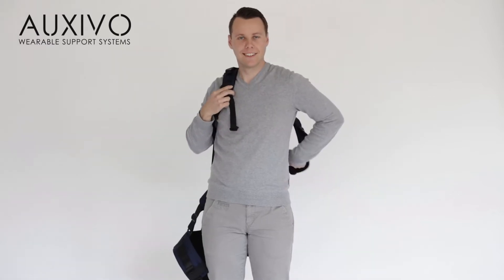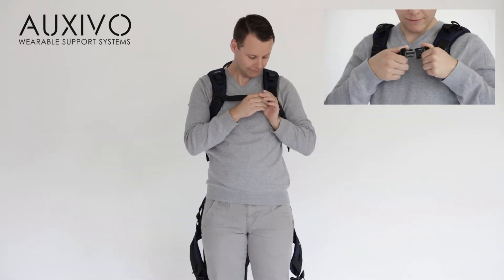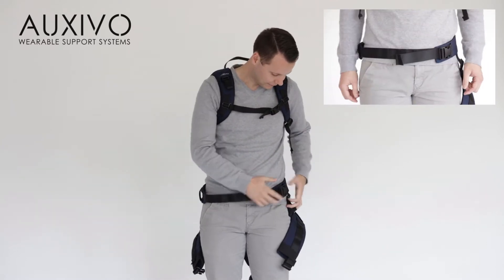We will start by guiding you through the steps for putting on the lift suit. Start by putting on the vest like a backpack, then close the buckles of the vest, the hip belt and the thigh cuffs.